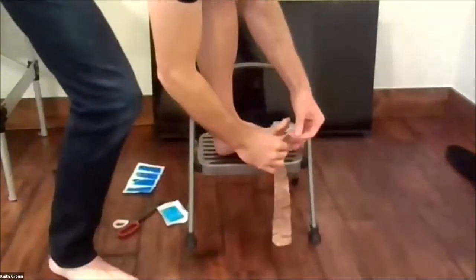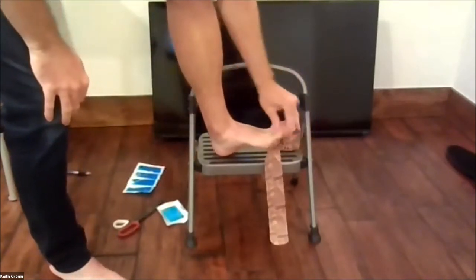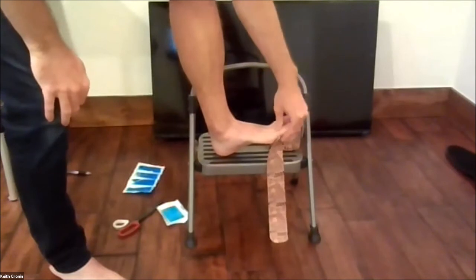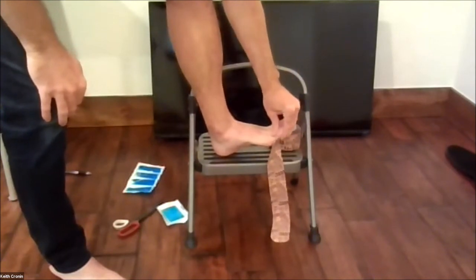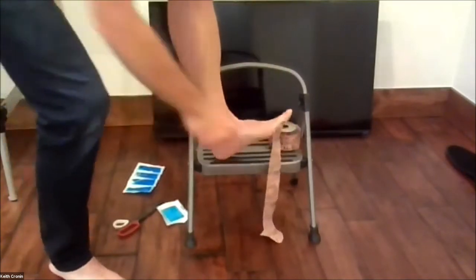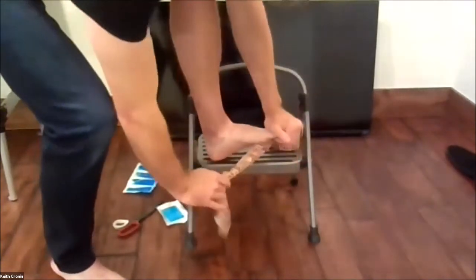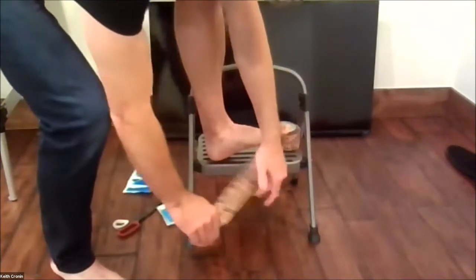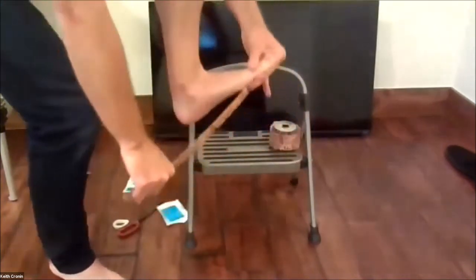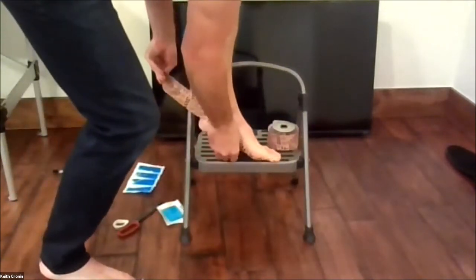Okay. So to do that, I'm going to put this tape on. I'm going to put it on my toe here, because I'm going to use the toe as the mechanism to actually get this thing moving. Now, if you've ever done kinesiology taping before, this is not kinesiology taping. So please understand this is completely different. All right. So I'm going to take this and put it in a shortened position. And what I'm going to do is take it along the underside of the foot. So I'm going to pull it up and come along the outside. Perfect. And I'll pull it around the other side, and I'll show you guys the end result.